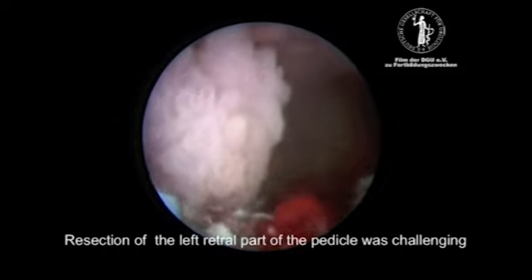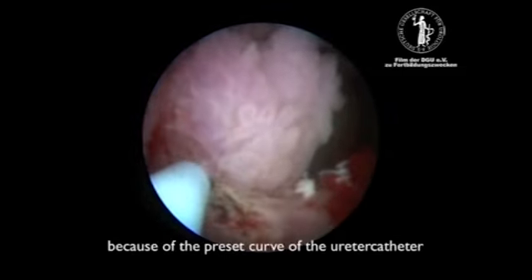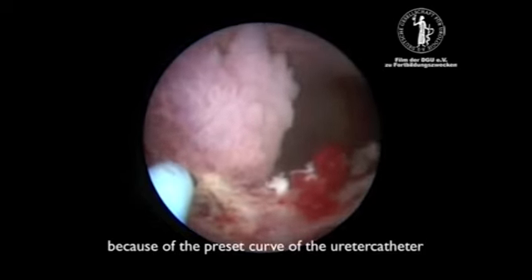It was difficult to reach the rear part of the tumor pedicle. For this purpose, a ureter catheter with a 10-degree higher flexure would be recommendable.